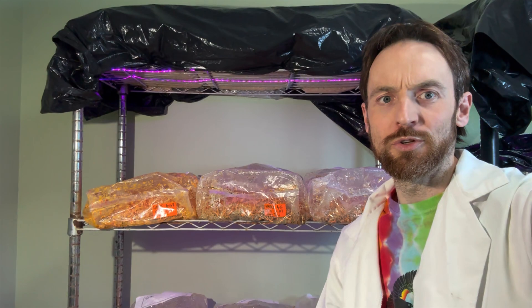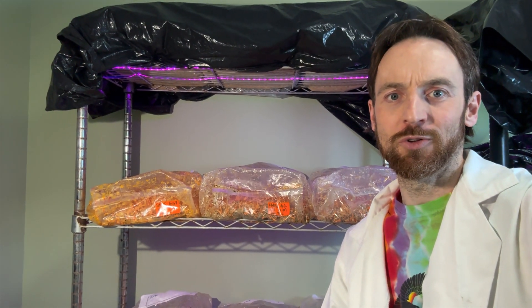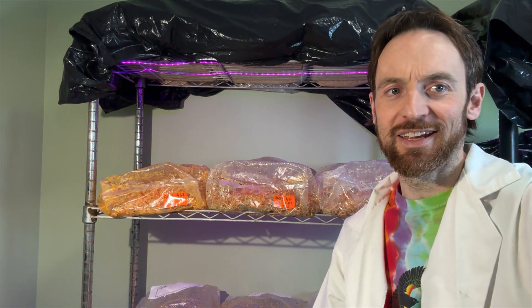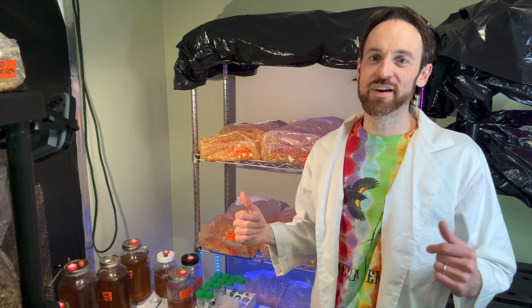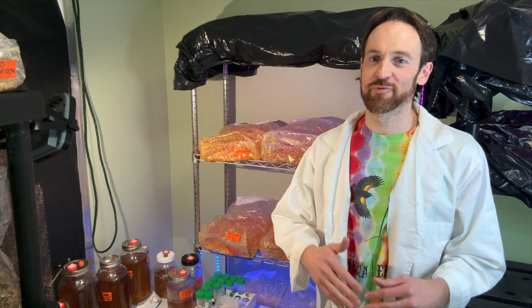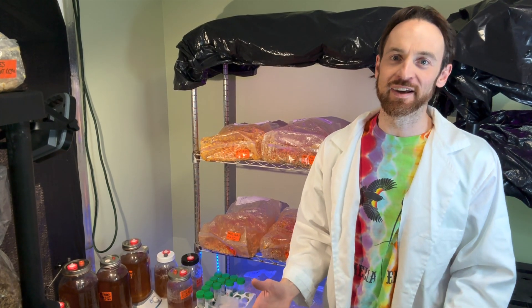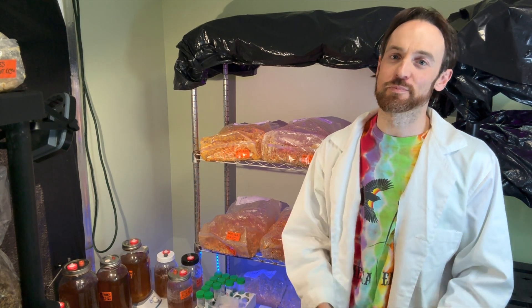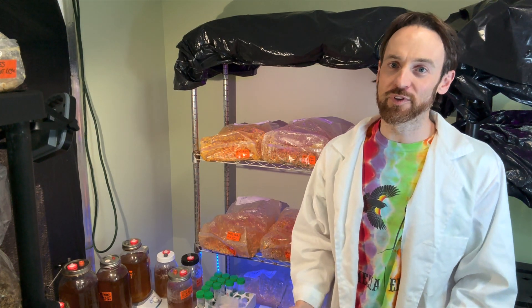We also used oats last year and did not have very good yields, but it was at the end of the season when it was just starting to get a little hot, so we should probably try again. In summary, rice far exceeds the other media in our experiments, but mixing rice with other small grains like sorghum or millet is also producing quite well.